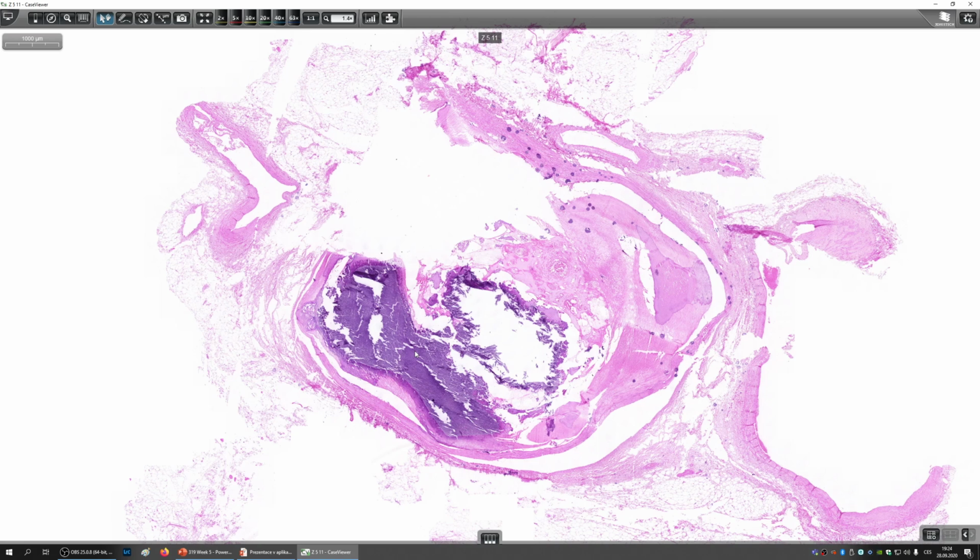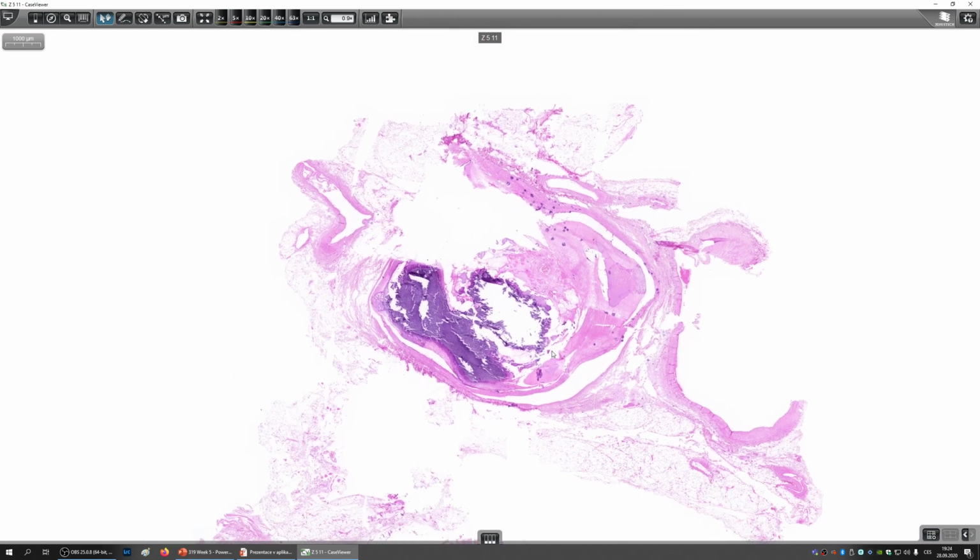In general, we say that critical ischemia develops when at least 70% of the lumen is closed acutely. But in some cases, if the closure is very gradual, even in the coronary arteries, you have enough time to develop collaterals. So this patient might have had a milder course of the disease. Naturally, this is also from a lower limb. So in this case, the ischemic disease of the lower limbs has also led to loss of said limb. But just understand that not every atherosclerotic plaque is the same. Some are less stable than others, and each is dangerous in different ways.